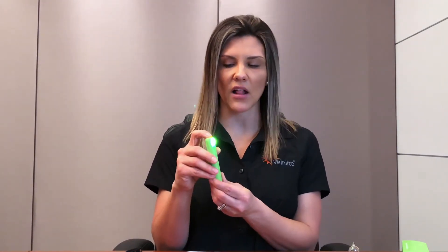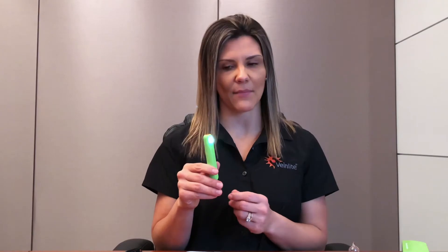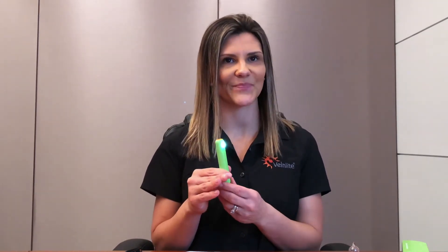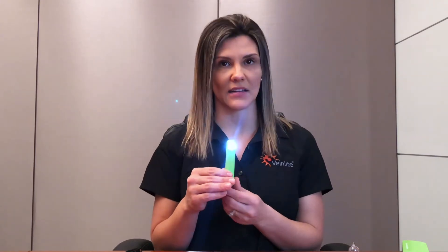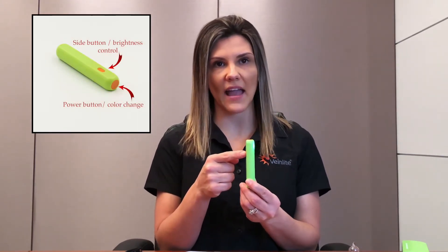Our third color LED will be our white exam light, which can be used in poorly lit situations. The Veinlight Neo also features a brightness control. In order to change the brightness levels, press the side button located on the device.